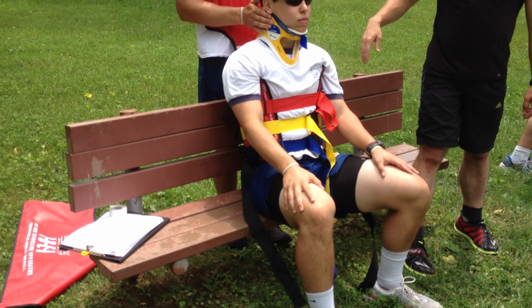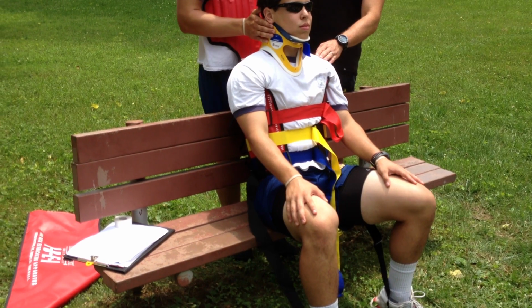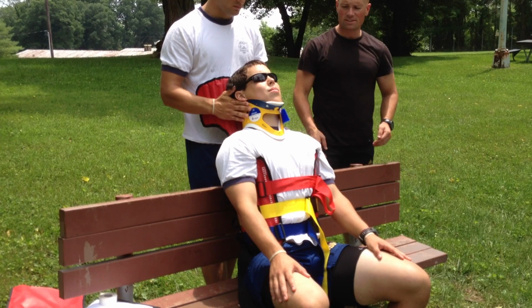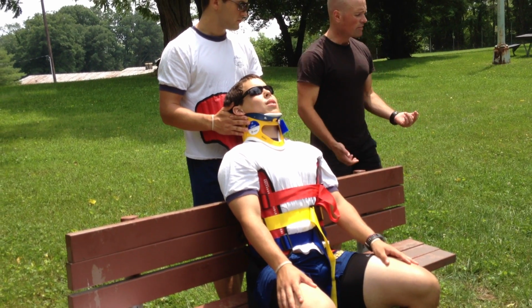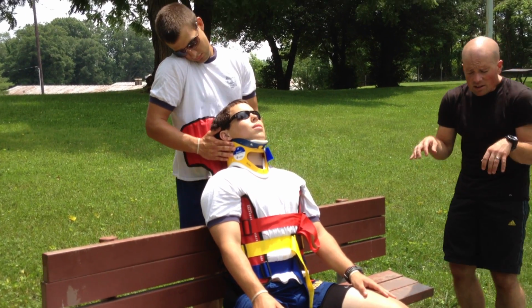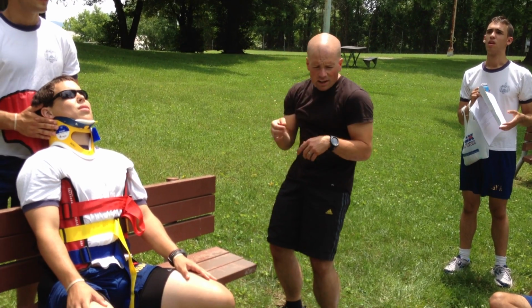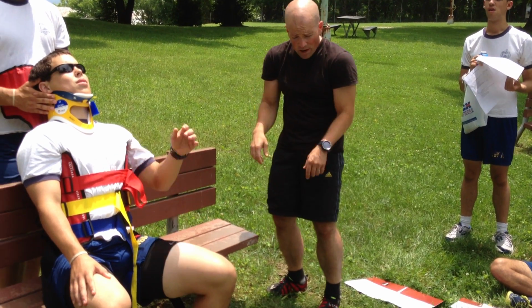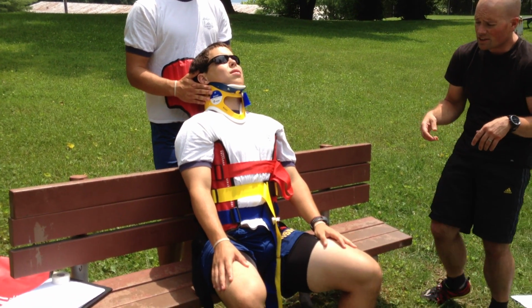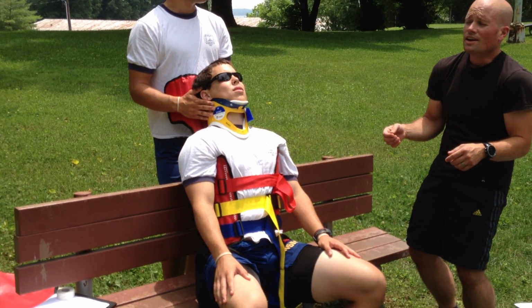Let's take a look at the head here. What I need to do is encourage my patient to sit up nice and tall and drop their head back so that hopefully it touches this device. Now you're all very young. You haven't had years and years of bad posture, sitting at a computer, video games. You don't have a very kyphotic spine like my grandmother does. My grandmother cannot touch the back of one of these devices. If I put my grandmother in this, she would sit back and I'd say, all right, put your head back, and she would go. And that's it.